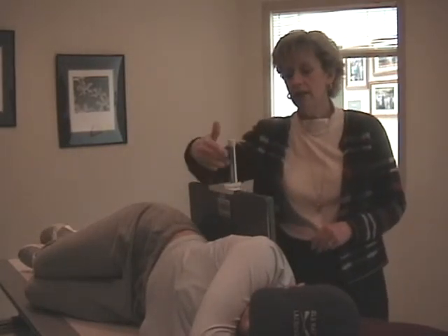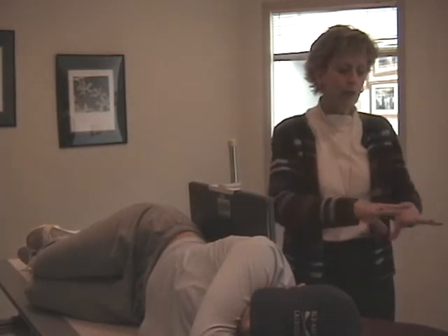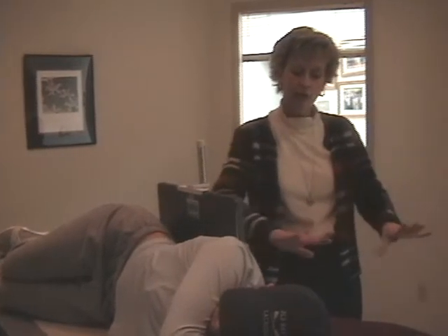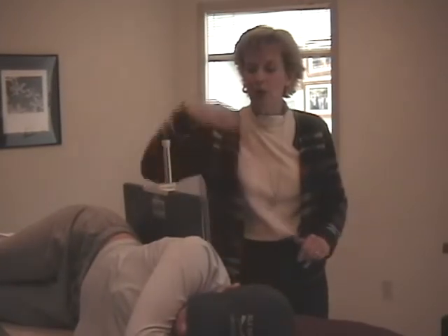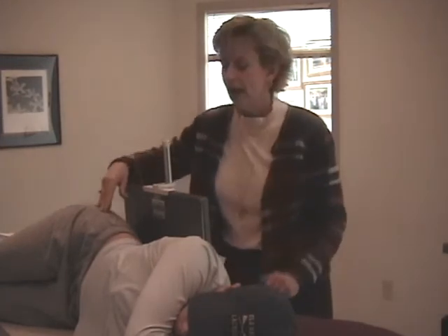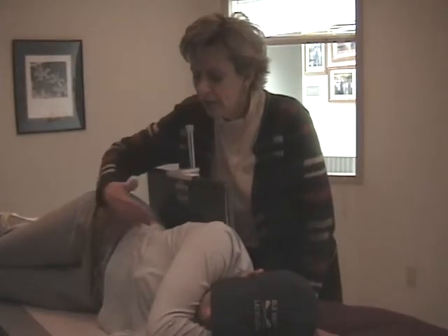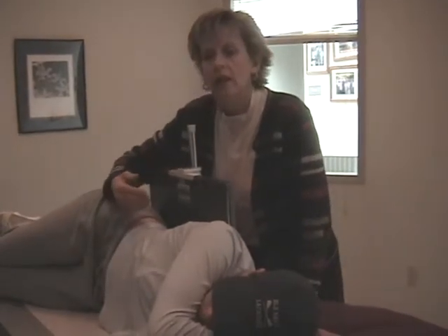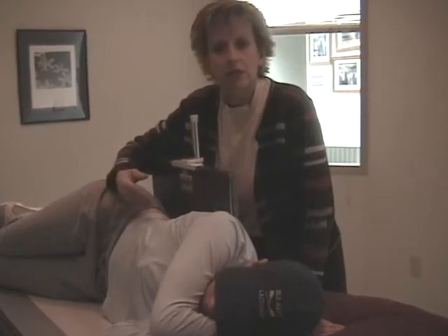And with Drea in this lateral position, I want you to think, when she was flat on her back, her tissue just kind of laid out this way, gravity, it just laid that way. When a patient turns onto their left side, gravity, the tissue will go closer to the table. It depends on the habitus of the patient, size, and muscle conditioning.